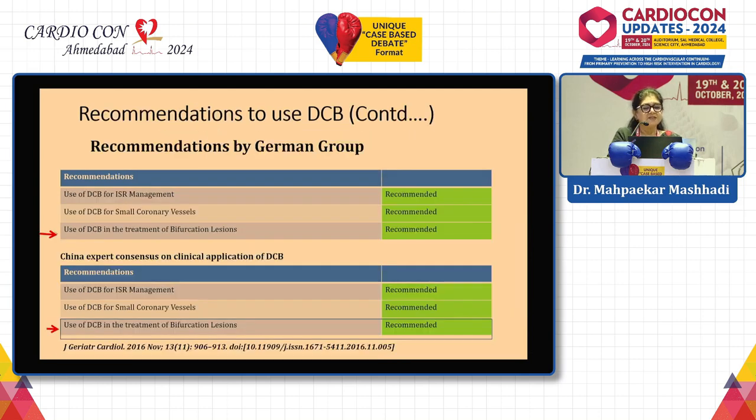So what are the recommendations? In this particular case, use of DCB in bifurcation lesion is definitely recommended, and even by the Chinese experts and the German experts, DCB in bifurcation lesion is definitely recommended.